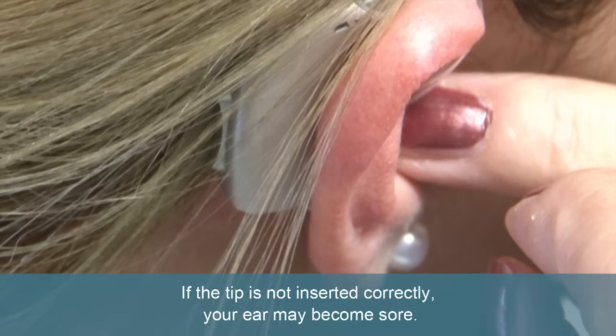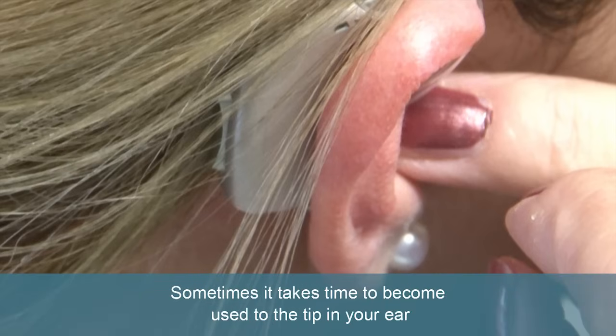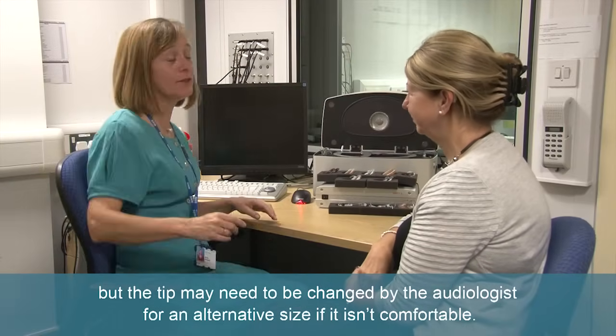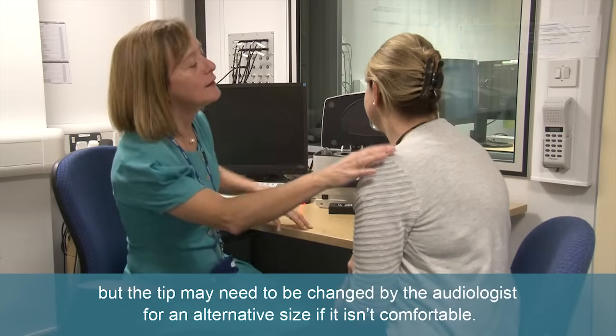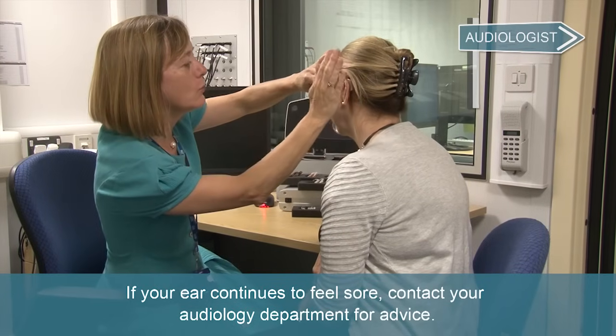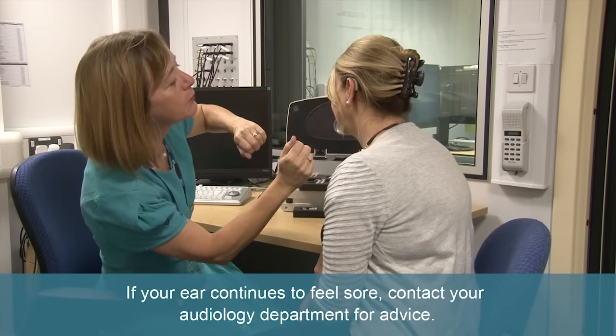If the tip is not inserted correctly, your ear may become sore. Sometimes it takes time to become used to the tip in your ear, but the tip may need to be changed by the audiologist for an alternative size if it isn't comfortable. If your ear continues to feel sore, contact your audiology department for advice.